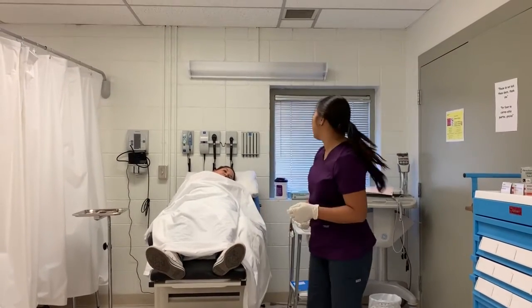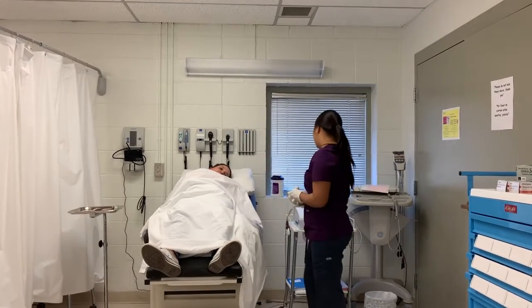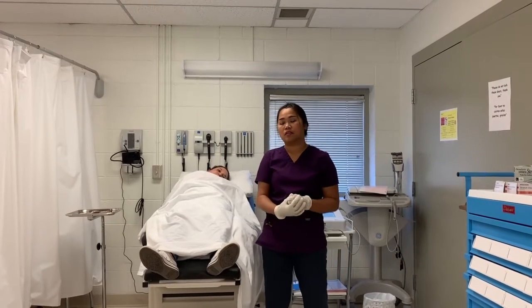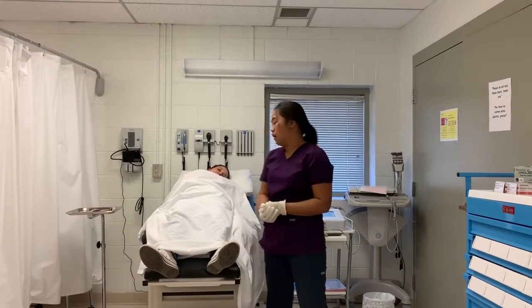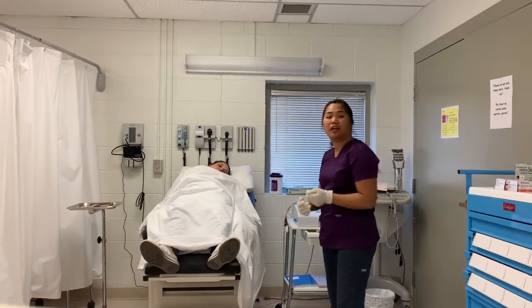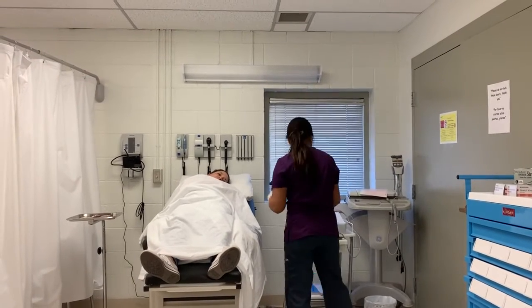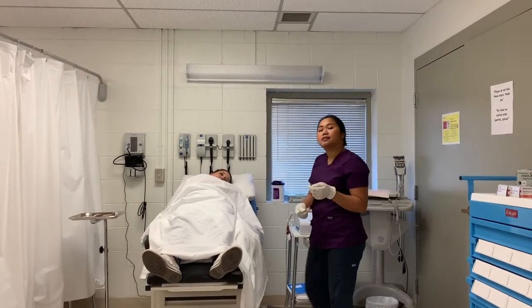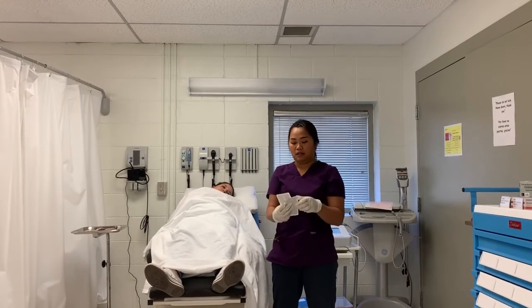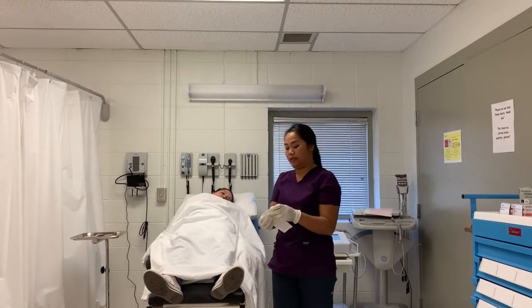I'm going to check the wall, see if the bed is touching it, and if there are any electronics that may interfere with the ECG test. Everything looks great. Now I'm going to clean my patient's limbs and chest so that the excess oil or dry skin will be removed and the electrodes will stick properly.